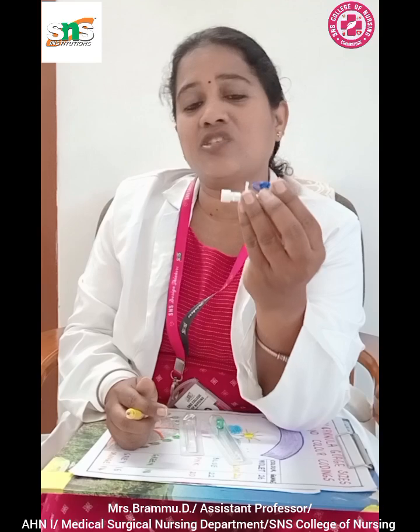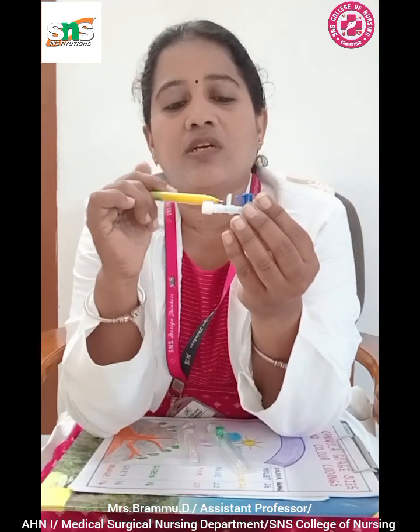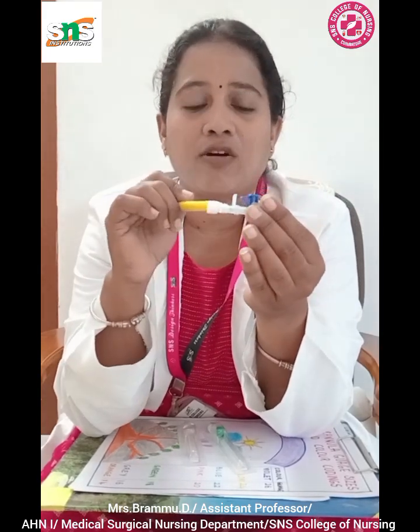You may ask why this is essential. It has been beautifully designed so that we can analyze whether we are in the right vein. This flashback chamber is nestled with the hub. You can see it is firmly attached to the hub, and it acts as a transparent reservoir that visually confirms successful vein entry by displaying the flashback of blood.